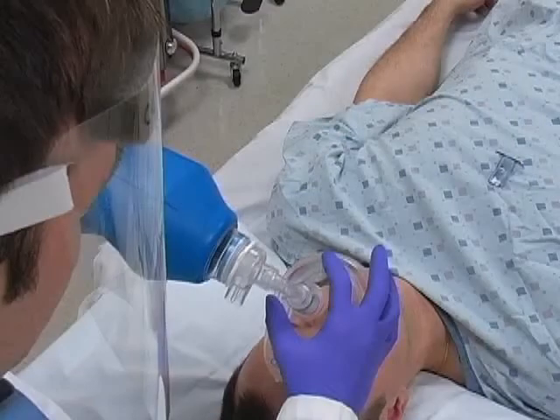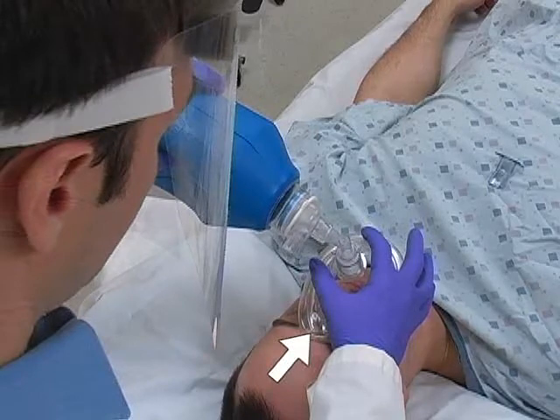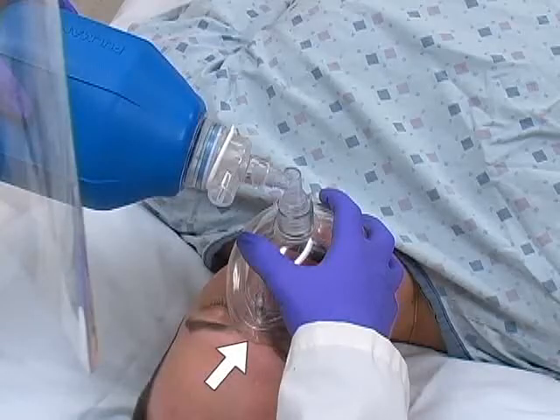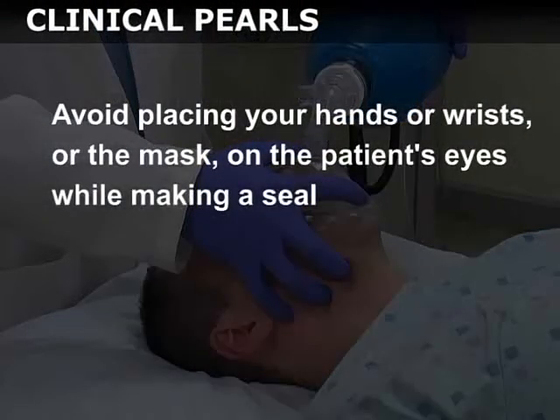Lower the mask onto the patient's face. First place the nasal portion of the mask over the patient's nose, and then lower the body over the patient's mouth. The bridge of the nose, the 2 malar eminences, and the mandibular alveolar ridge must be covered by the mask in order to achieve a proper seal. Avoid placing your hands or wrists or the mask cushion on the patient's eyes while making a seal. Doing so may cause a vagal reaction or ocular injury.